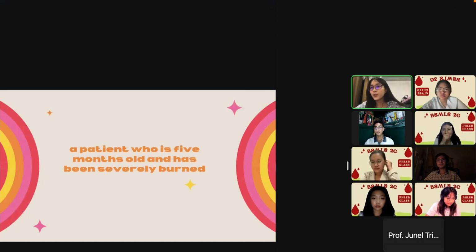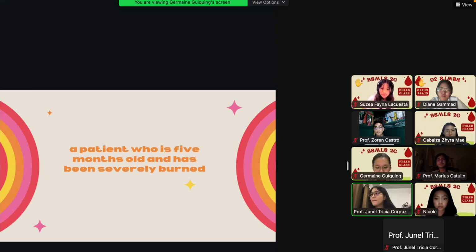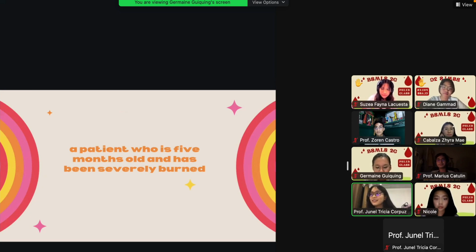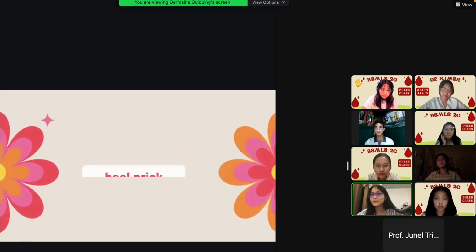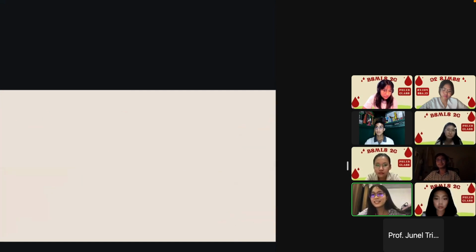First, a patient who is 5 months old and has been severely burned. Where to prick? Anyone? Okay, Miss Suzea? Ma'am, heel prick po. Okay, let's see if Miss Suzea is correct. Very good.